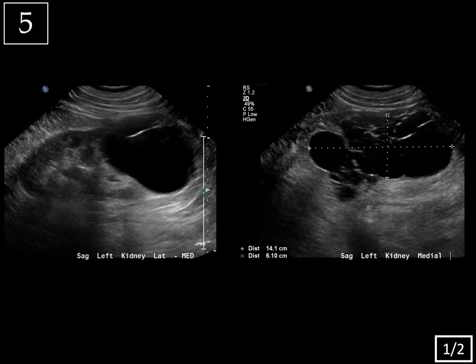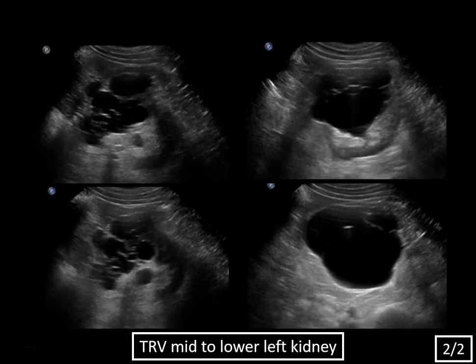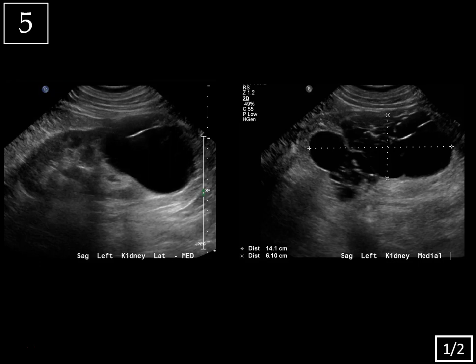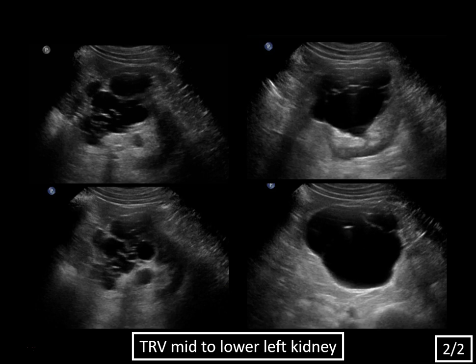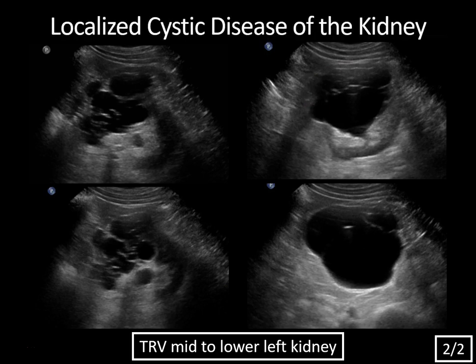Last case — slides 1 and 2. Here we've got two sagittal images of the left kidney, and you can see a multiloculated cystic mass in the mid to lower pole. We don't really see a solid component, but there are numerous septal interfaces. On the transverse images of the mid to lower left kidney, this cystic mass has a lobulated contour — it's not well encapsulated and not ball-shaped. There's also a suggestion of normal renal parenchyma interdigitating between these cystic areas.